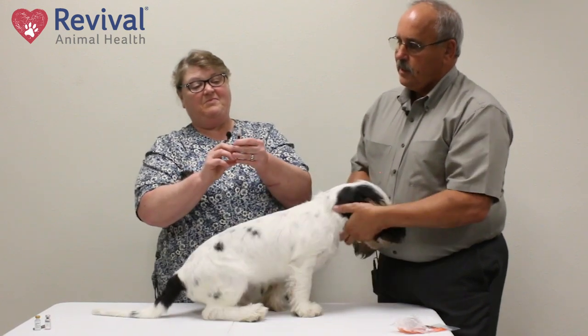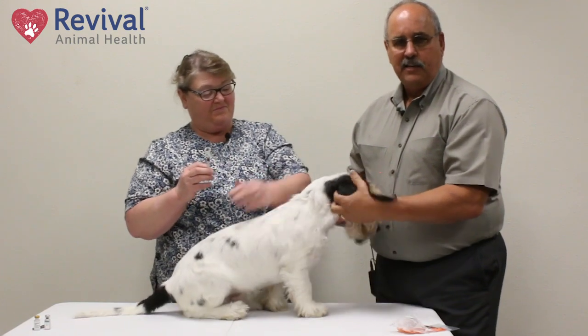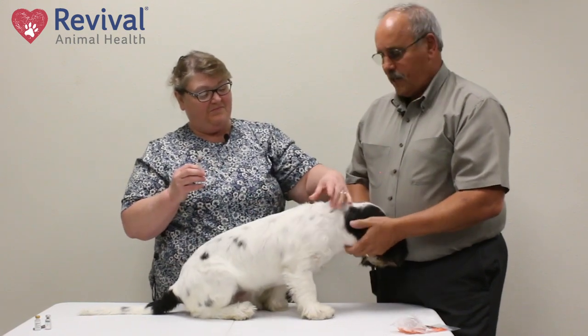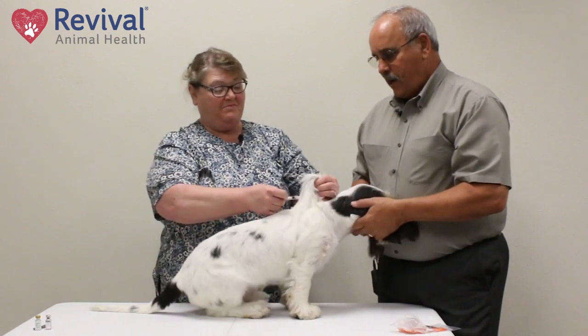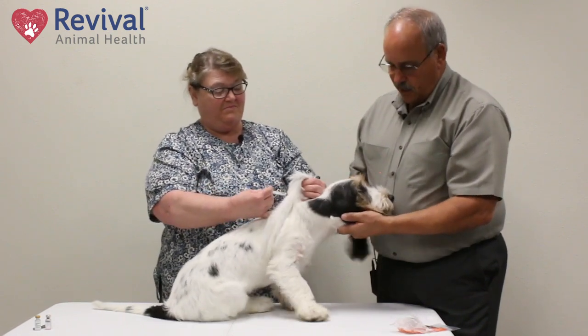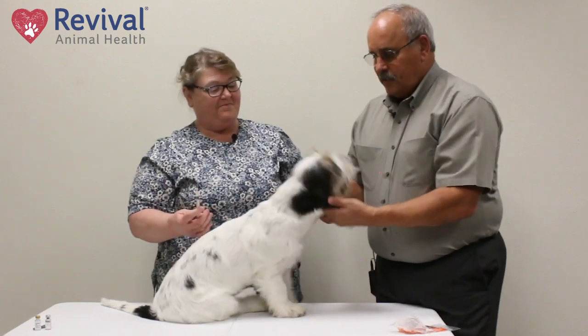You can just click it with your finger and then blow it out. There's plenty of vaccine there, so don't hesitate if you've got a drop or two that you lose — it's not going to hurt. Tent the skin and go with the skin. She's going to go right under the skin and you can see he didn't care as long as he knows that mom's there. Give the vaccine and she's done.